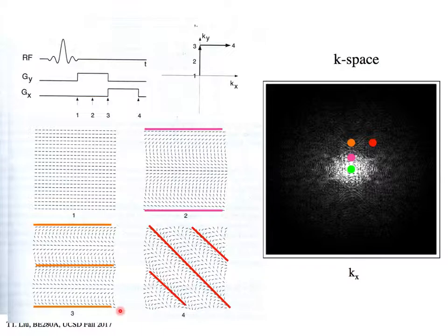Now, if I add up the signal that is proportional to the sum of all of those magnetization vectors together back into my coil, that is essentially like applying the Fourier transform, applying a k vector to that object, and then sampling what the amplitude of the signal is. Right? So that k vector has a value in y. In x, you can see we have no change in phase as a function of x. And so the kx value, the Fourier component in the x direction, is 0, or at dc, whereas in the y direction we have 2 full cycles here.